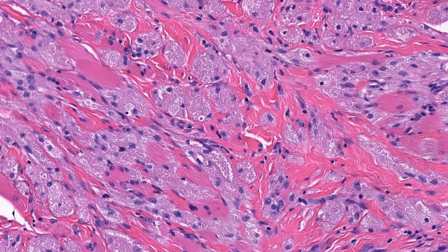As the name implies, tumor cells have abundant eosinophilic granular cytoplasm that is PASD positive, so PAS diastase resistant. The large granules are called pustulo-ovoid bodies of Milian, which is definitely something your attending will ask if you come across one of these. By immunohistochemistry, cells are positive for S100, SOX10, MITF, and CD68. Most cases are also positive for nuclear TFE3, inhibin, and calretinin.